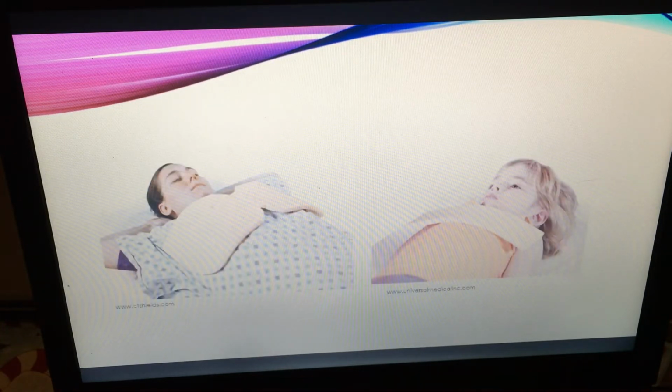Bismuth shields are very easy to use. They are placed directly on the patient and do not cause any discomfort. They come in all sizes, including adult versus pediatric, to properly fit each patient.